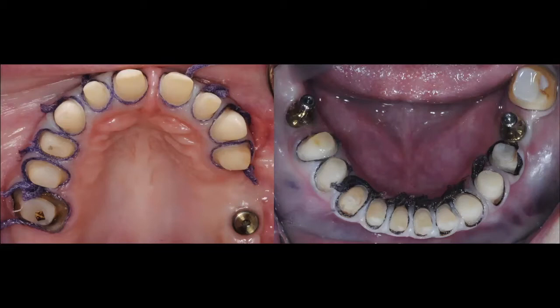You have an option to go for a more translucent type of zirconia, and you have to understand that if you do select more translucent types of zirconia for your anterior teeth, they're going to be different aesthetically than if you choose a stronger zirconia or a more opaque zirconia for your posterior teeth, which I would recommend.